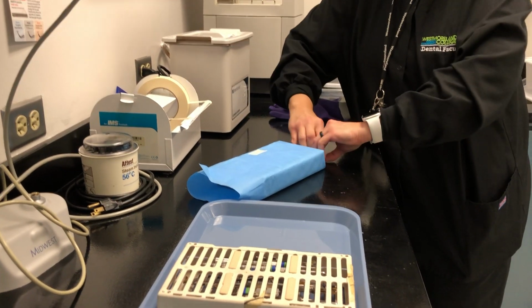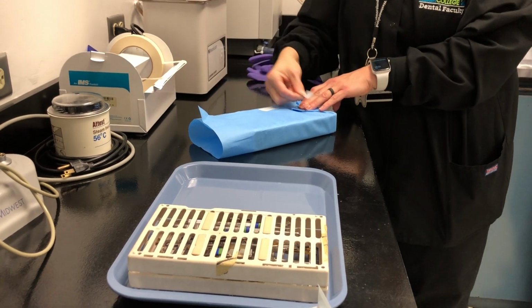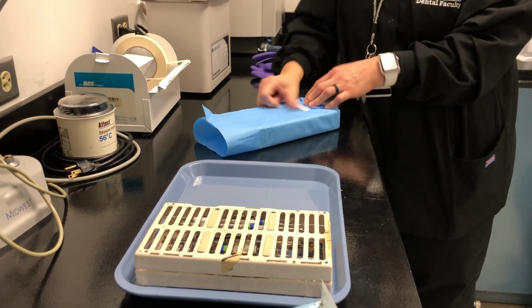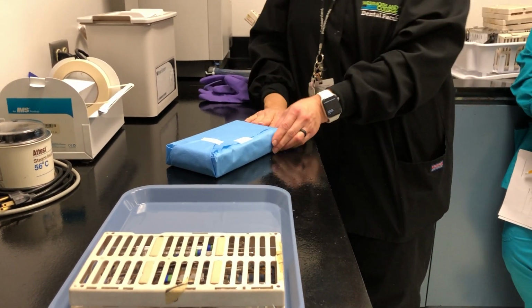And to those that remember that wrapped with me, what do you need to look at if it's a student's cassette, or say you're in an office and it's a certain procedural cassette? The name and number on the end. Perfect, good job.